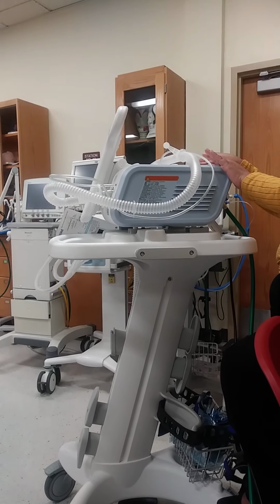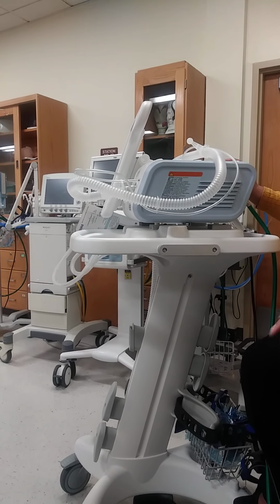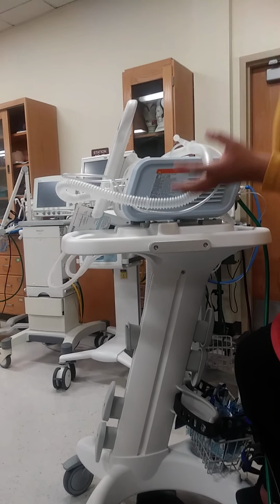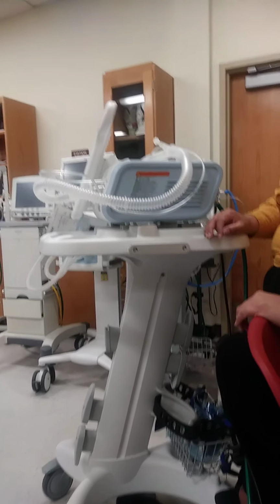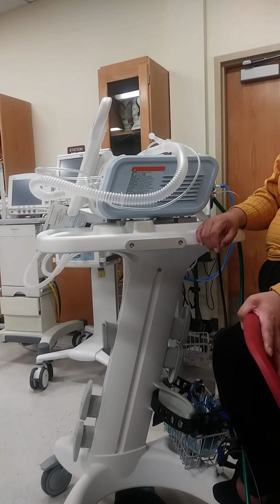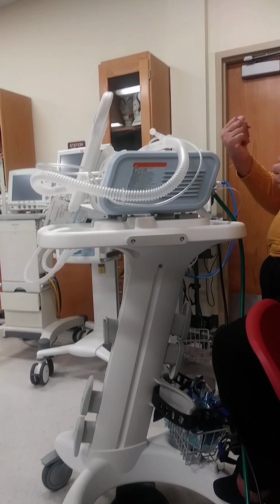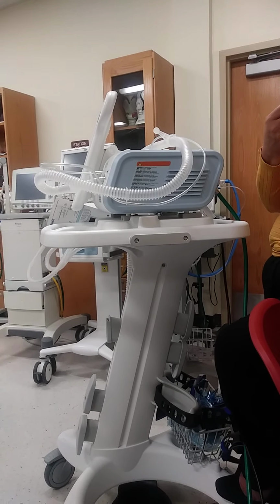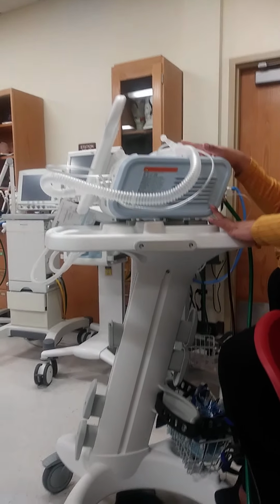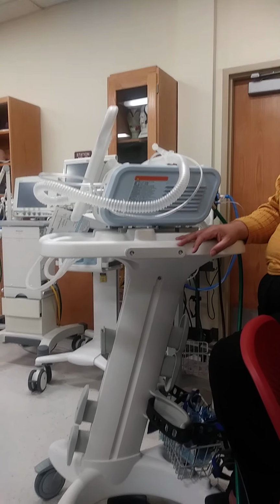So there's a lot of risk with this if your patient can't protect their airway. What if they vomit? And then the vomit just goes back into their lungs, they aspirate, okay? Can it happen with your patient being alert and oriented? Yes, it's happened to me. But those are contraindications and you have to advocate sometimes for your patient and tell your doctor, hey, my patient is not able to take off his mask, he can't follow commands, I don't feel comfortable putting him on this. So if we put it on him, you know, your license, not mine. Okay? So those are some big contraindications, okay?